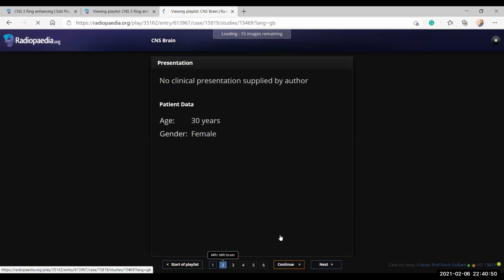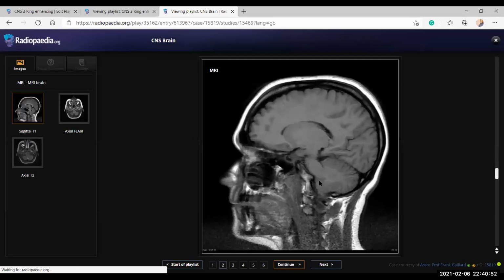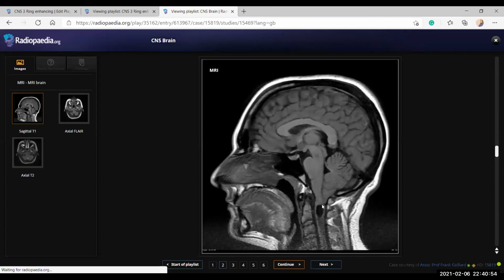And this one also. You said that you will do a contrast examination to rule out a mass. That is correct. And you should also complete the spine imaging, like the cervical spine and other spine. You just have to do the spinal MRI also. Otherwise, this is also fine.